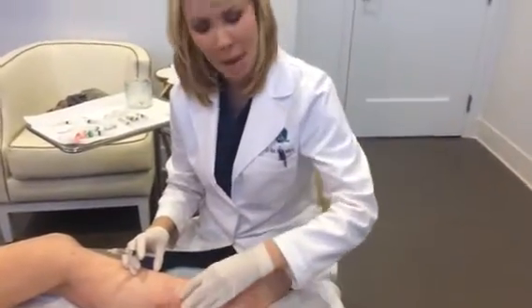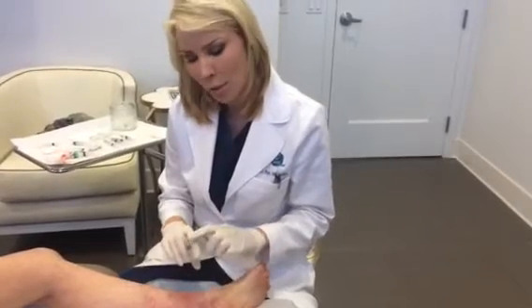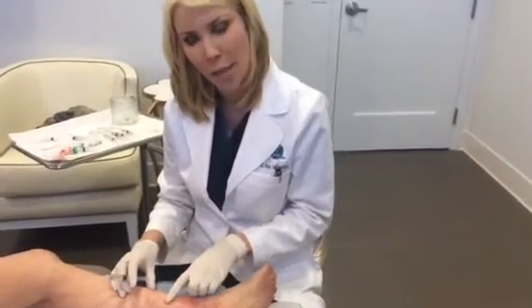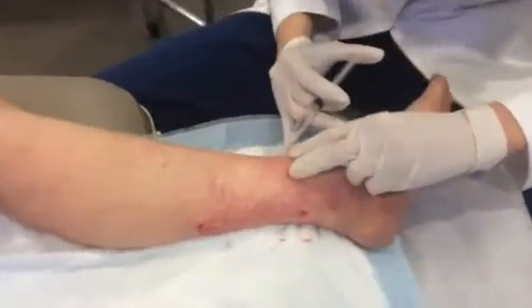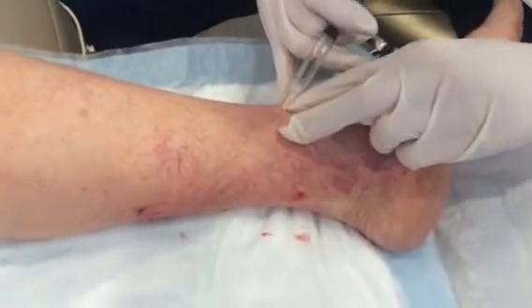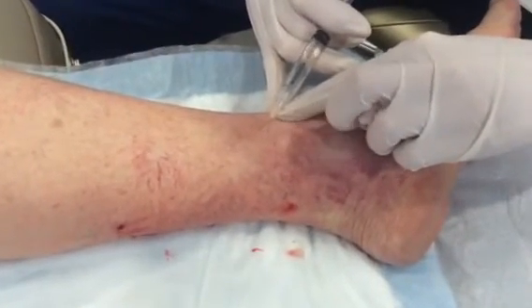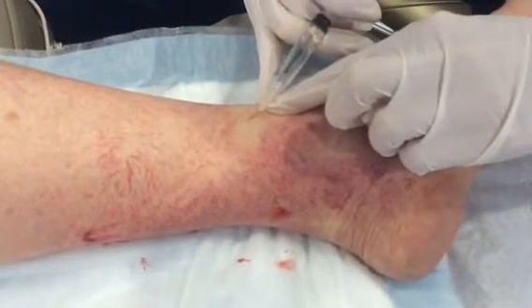We've actually treated the back of her leg, and I'm just going to show a couple little pokes of how we treat with a glycerin solution, which is a sugar solution, these little veins. So we'll get up close and show a couple of injections. We're going to go after this one, and you'll see the whole area kind of light up and blanch when we're actually in that nice little vessel, so you can actually see that color change.